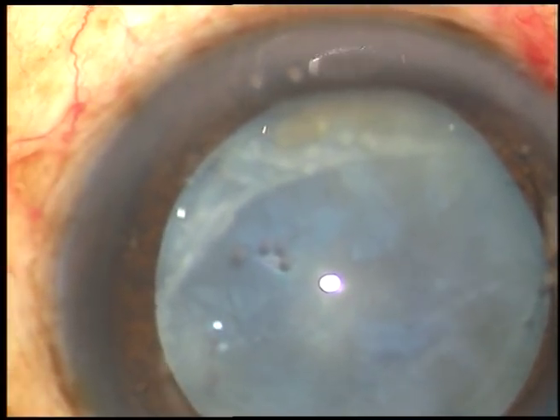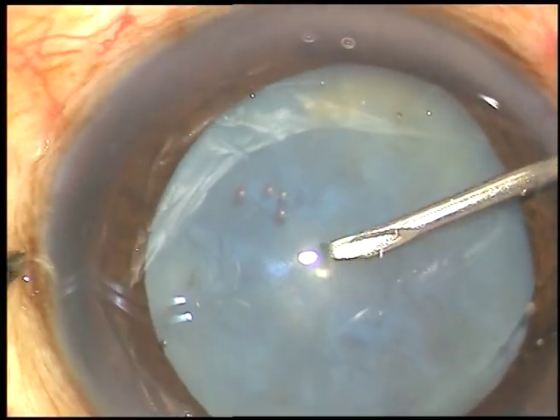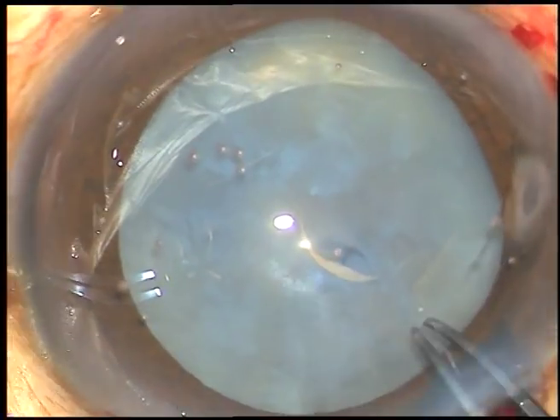And now, I am going to do capsulorhexis. You will be able to see the rhexis very nicely in this case since the capsule is stained. The capsule is incised and a nice flap, which is very easy to hold with the utrata forceps, is raised.